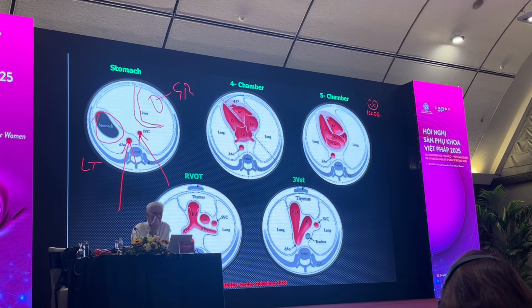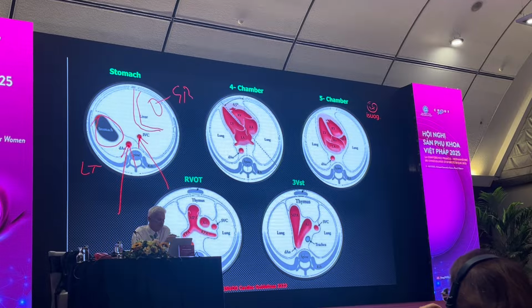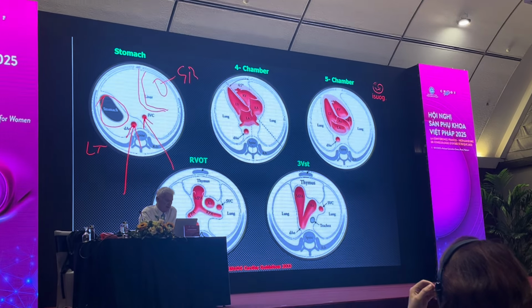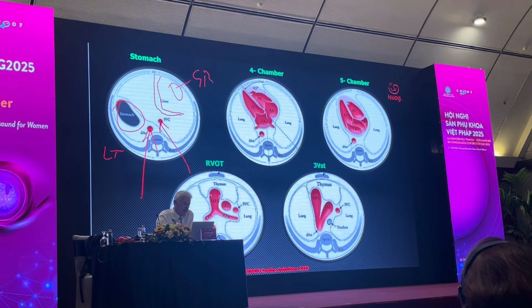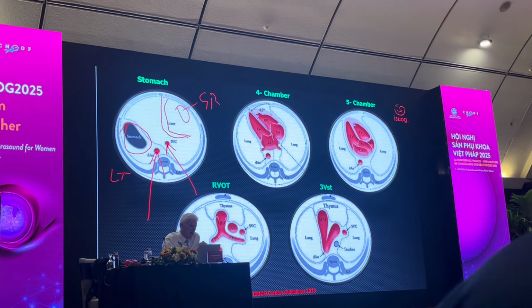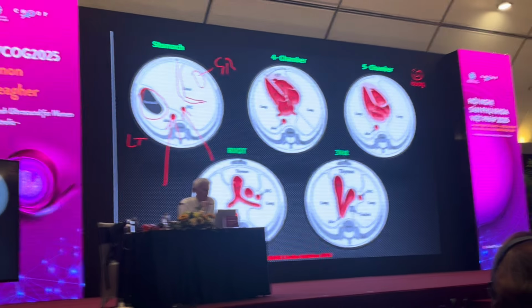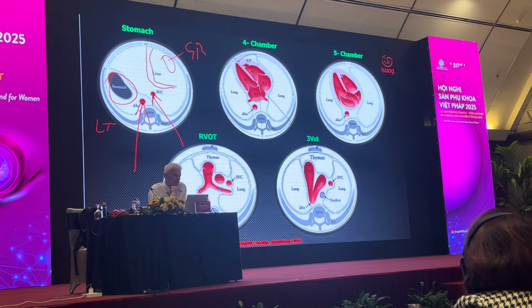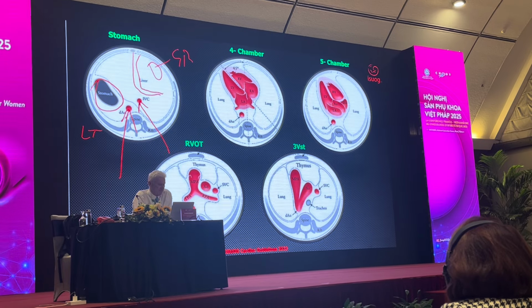So for every cardiac examination that I do, I look at these structures. Confirmed, stomach's on the left, 1. Descending aorta left, spine, 2. IVC anterior to the right, 3. Intrahepatic veins sweeping away from the stomach, 4. Gallbladder on the right, 5. So the heart doesn't start with examining the heart, it starts with examining the abdomen.